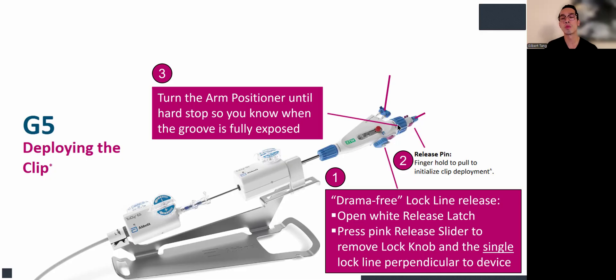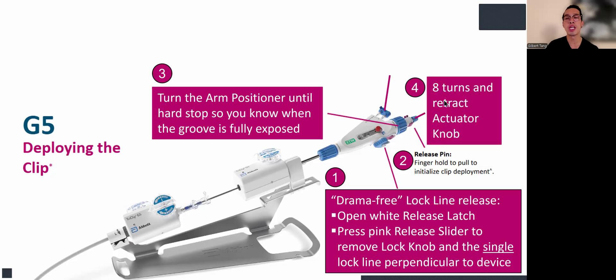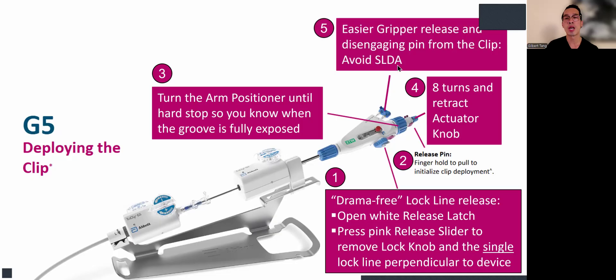You do eight turns and retract the actuator knob, and then you have raised the grippers and disengaged the pin from the clip. The grippers are now much smoother — easier to raise and drop them, and very easy to release. We noticed that disengaging the pin from the clip is much more easily done, so you don't have to be nervous about disengaging it and causing SLDA or hitting the mitral valve or the clip. This is much more ergonomic now.